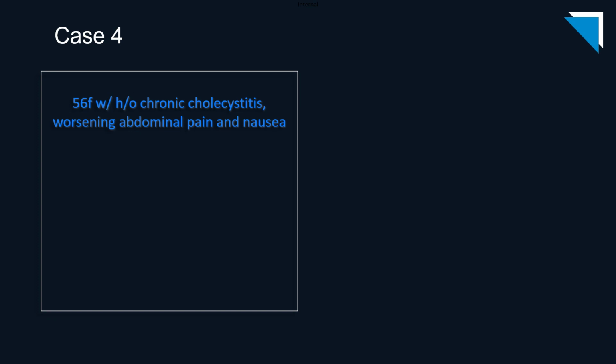This is a 56-year-old woman with a history of chronic cholecystitis presenting with worsening abdominal pain and nausea.